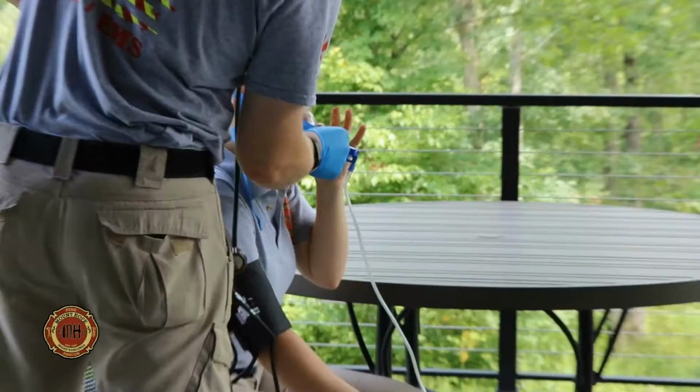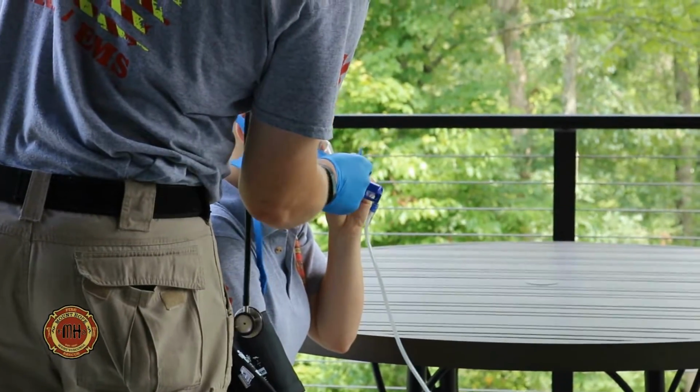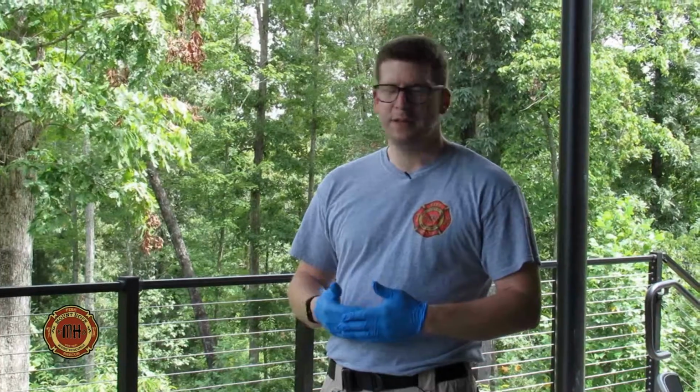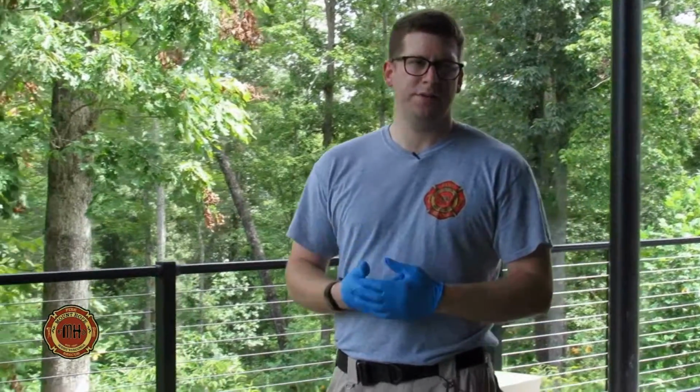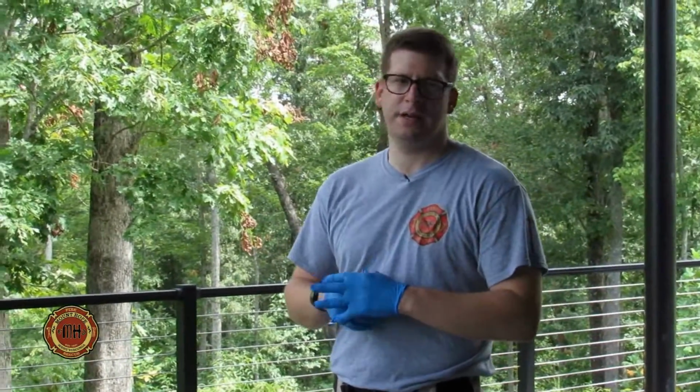After about 3 to 5 minutes, and the patient seems to be accepting the device, you can apply the straps and check for leaks. And you're going to want to keep monitoring this patient's vitals the whole way to the hospital and during your entire transport.